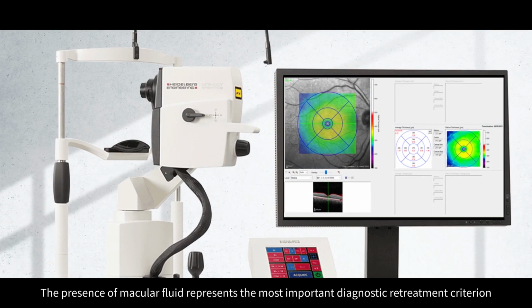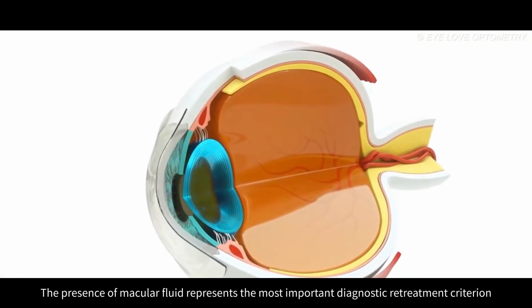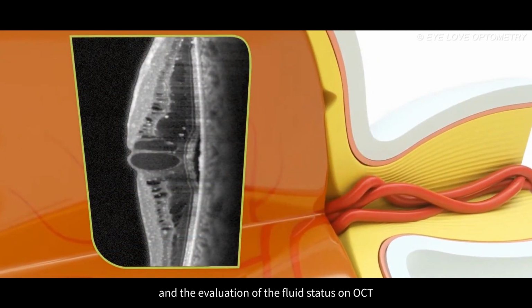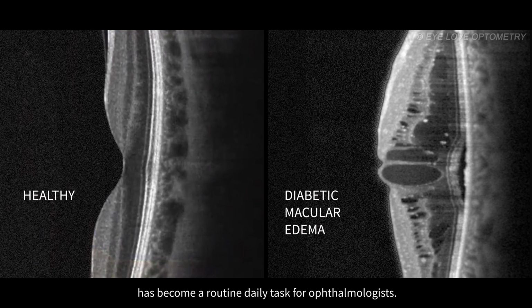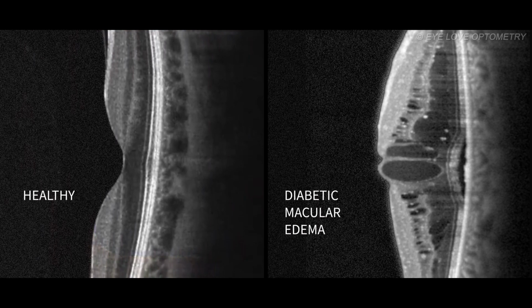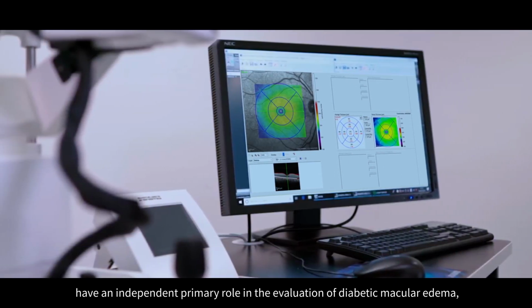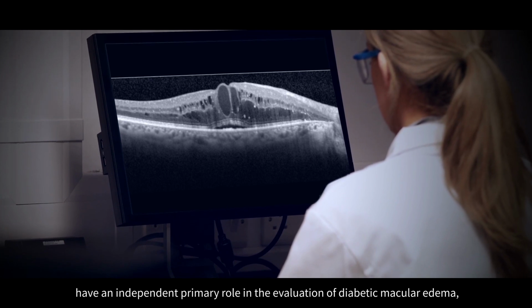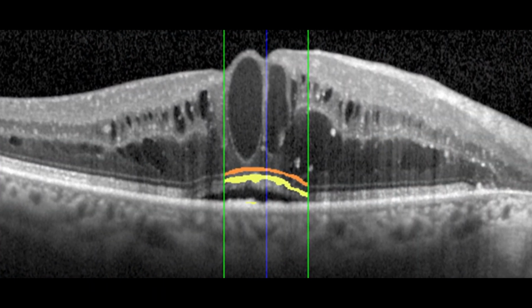The presence of macular fluid represents the most important diagnostic retreatment criterion in the management of patients with exudative macular disease, and the evaluation of the fluid status on OCT has become a routine daily task for ophthalmologists. The external limiting membrane and the ellipsoid zone have an independent primary role in the evaluation of diabetic macular edema, particularly from a visual prognosis point of view.